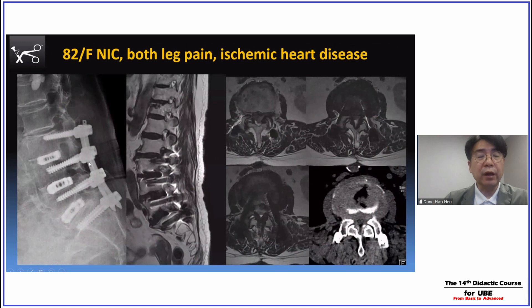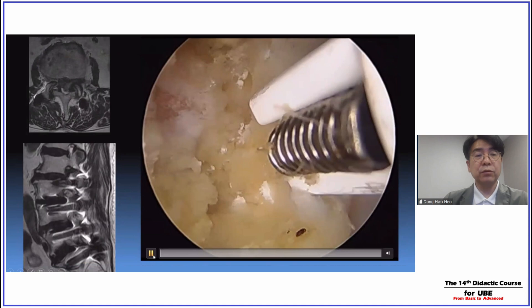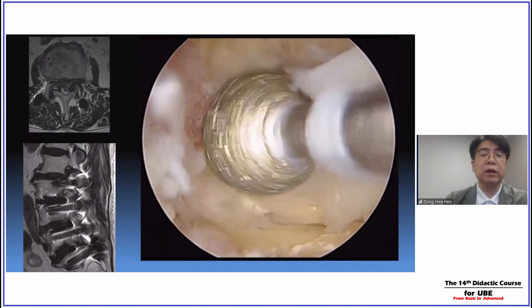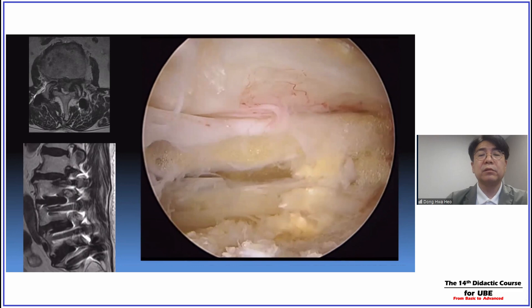Case 2: this patient presented with severe bilateral leg pain. You can see severe stenosis and posteriorly migrated ruptured disc herniation. This patient had multilevel spinal fusions about 10 years ago, but has a long history of ischemic heart disease, so I could not decide on fusion extension procedures. Also, the patient does not want fusion extension, so I performed the ULBD with the contralateral approach. I did an L2-3 laminotomy, and you can see the severely hypertrophied ligamentum flavum on the contralateral side.